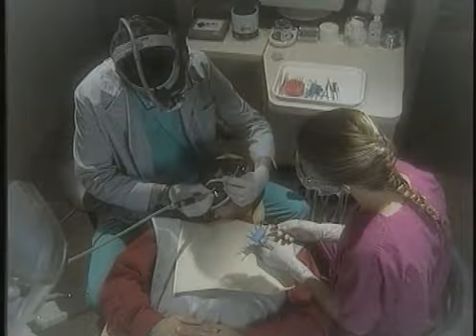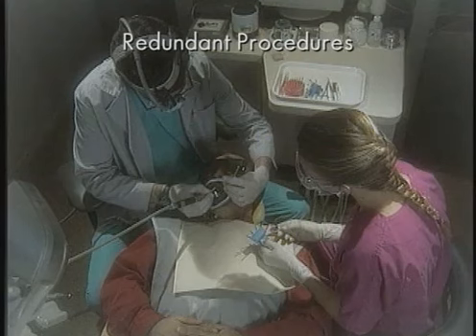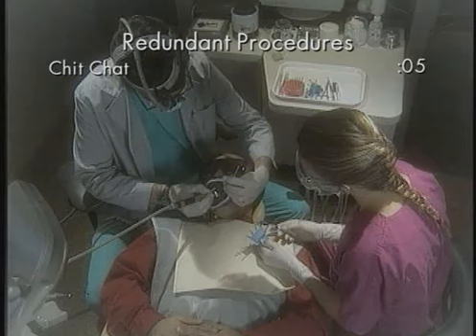Assume clean and shaping procedures are complete and the master cone or cones are fitted and verified. At this point, you probably need only 10 to 15 more minutes to complete the case, but for whatever reason, the patient is rescheduled. The question is, how much non-productive time is spent rescheduling? In my experience, bringing a patient back for a second procedure requires several redundant procedures such as chit-chat. Chit-chat may be a few moments, or based on your personality, may be several minutes.